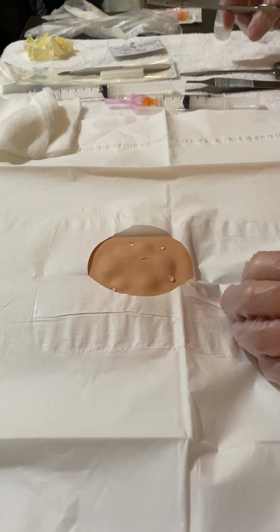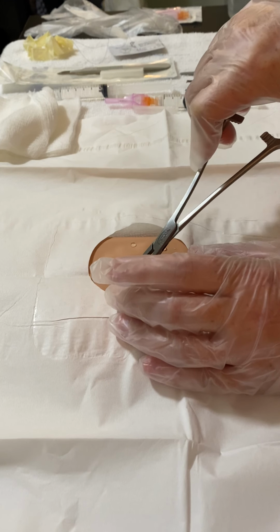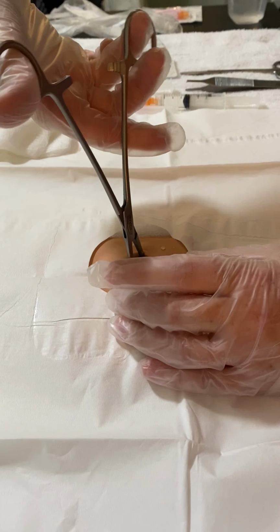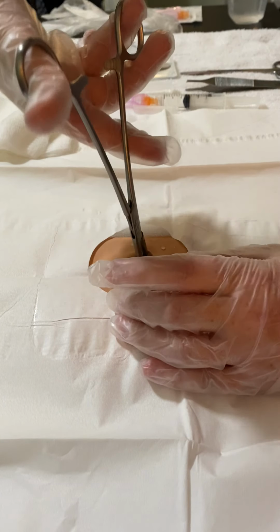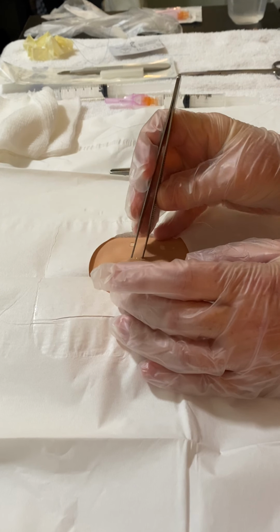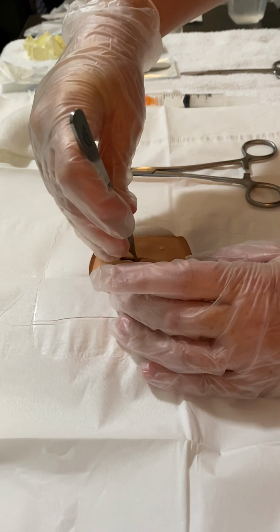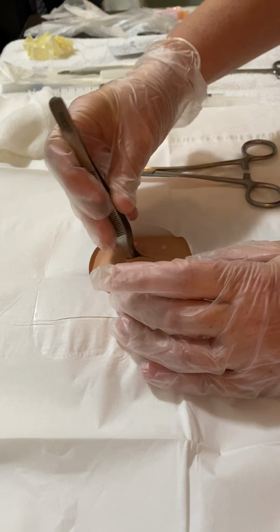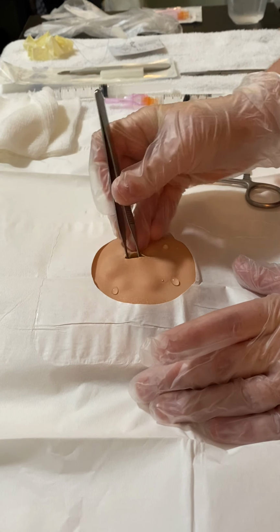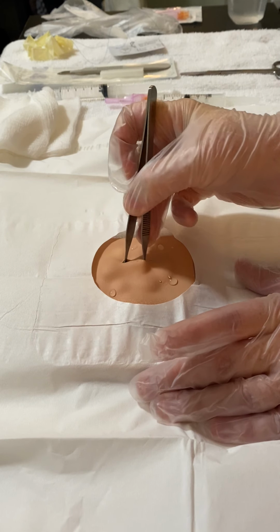And from here, I could use my forceps to attempt to open the area. And I would move around the perimeter of the cyst to attempt to dislodge the sac of the cyst from any adhesions where it could be attached to the wall.